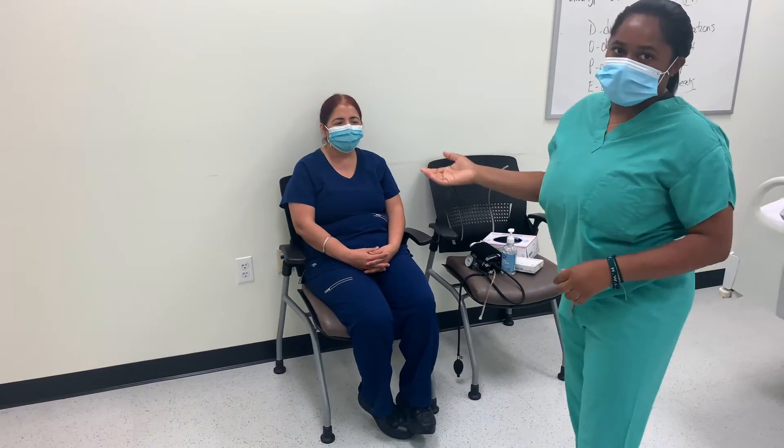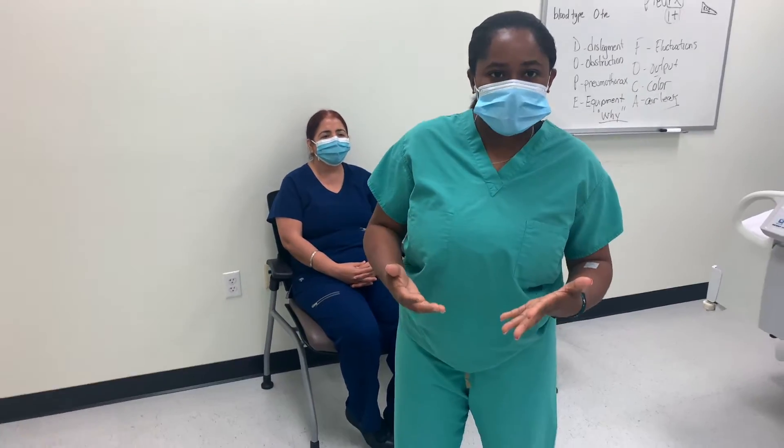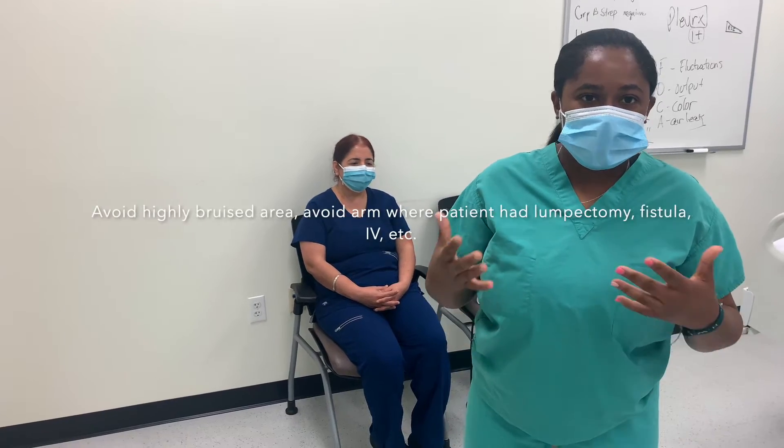So I do have my patient here. A few things to know before you take a manual blood pressure — you want to know a little bit about the patient history. You also want to know if the patient has a continuous pulse ox on, because that could interfere with the oxygen level reading. You also want to look at the nature of the patient's skin and avoid any arms with IVs, lines, or contraindications like patients on dialysis. Make sure you're looking out for these things before you do a manual blood pressure on a certain site.